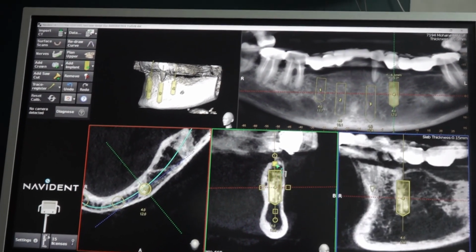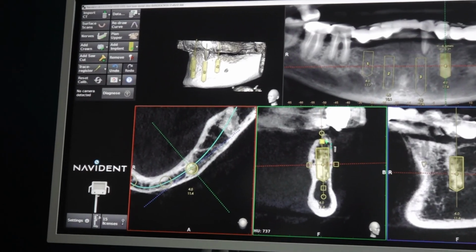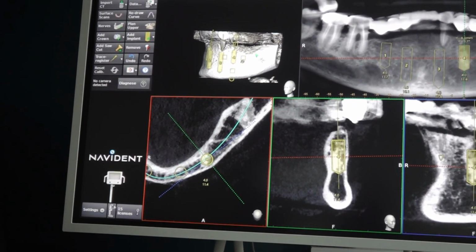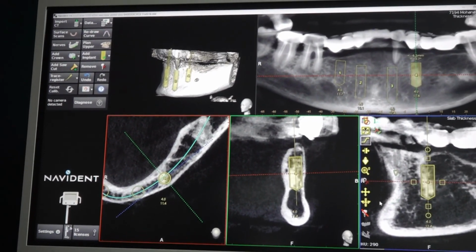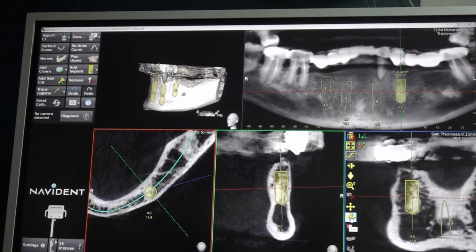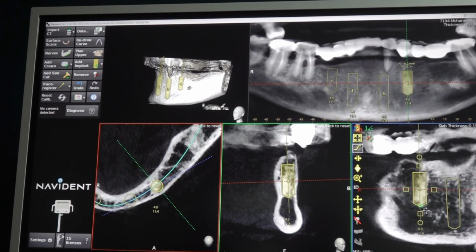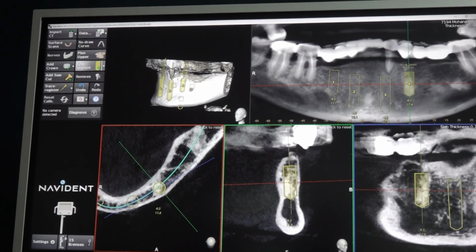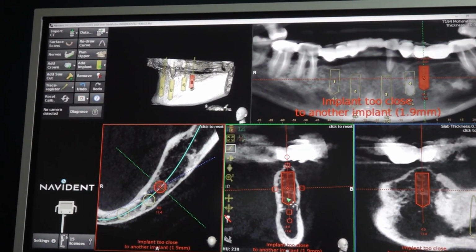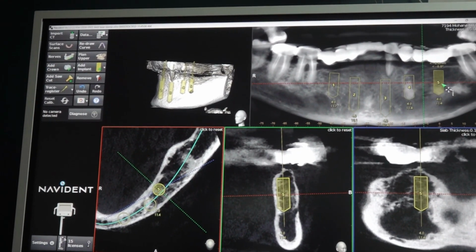Anyhow, we'll be doing some alveoloplasty here. So it is only a 10 mm implant in the second premolar, right? Post alveoloplasty you will get less bone. You will see the mental foramen is very far away. No issue. If there is a distance from the mental foramen, we will just see above the mental foramen. A very short implant we can place. However, we are not going to choose this area.